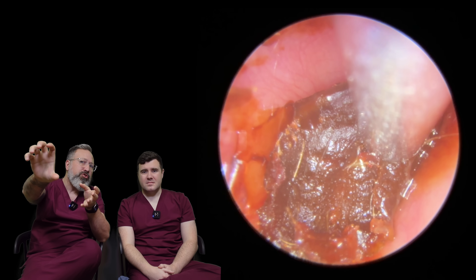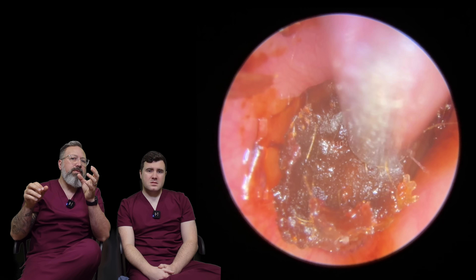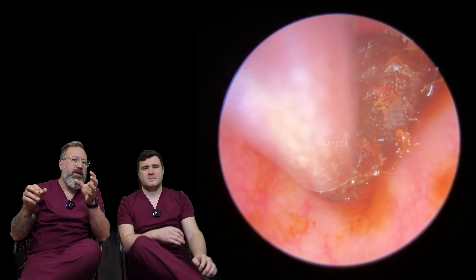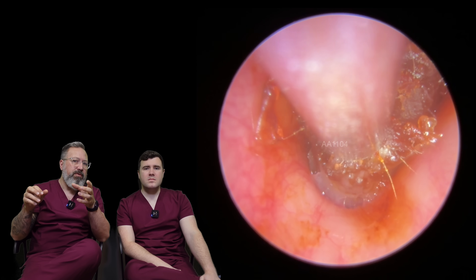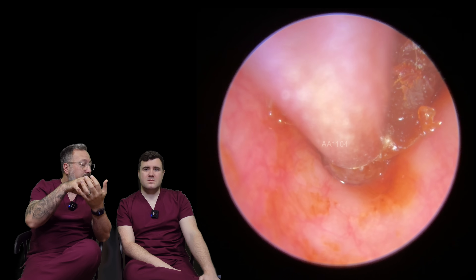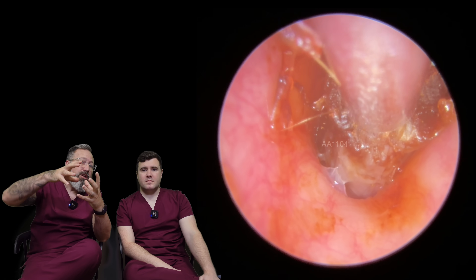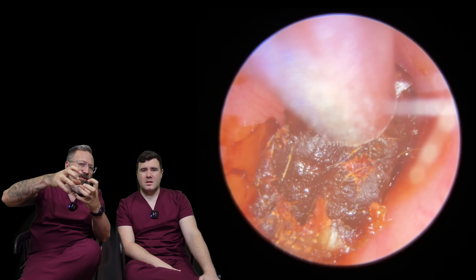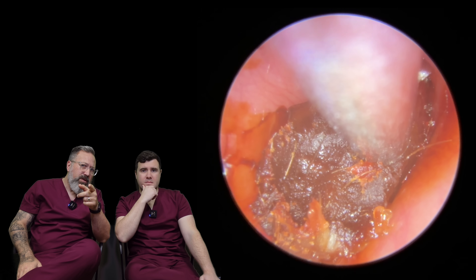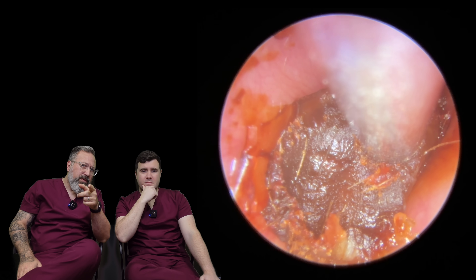What I'm going to do is use this top right corner to draw down the canal instead. A common misconception of a wax-from-wall removal is you've got to do it quickly — get in and get out. But sometimes with stubborn plugs, the slower you do it, the better it is for the patient, and the easier. Because sometimes you'll just hold and maintain that grip, and the pressure builds inside the suction tube to draw the wax plug onto the end. And that's what I do here — I hold it and very, very slowly pull this down.